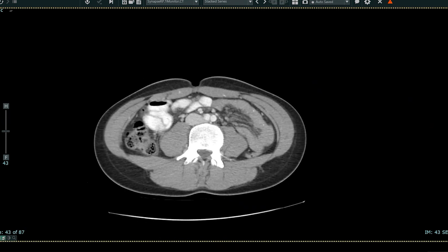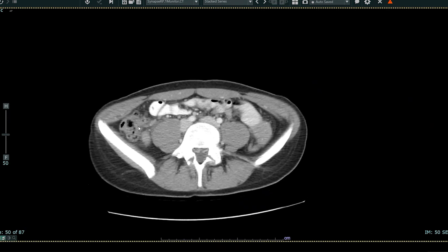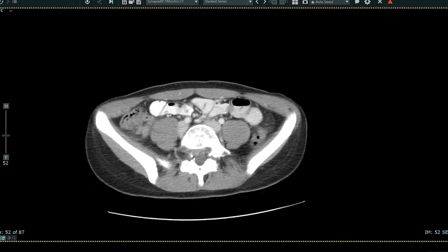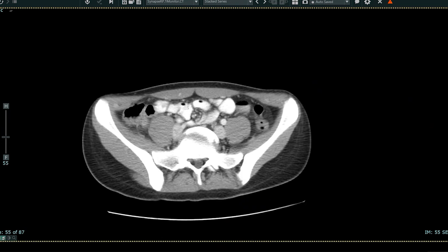And then as we get further down in the abdomen, we start to see bowel loops. These brighter loops here are loops of small bowel — the patient drank contrast and that makes the small bowel loops brighter. And these areas here, which have a mixture of darker and gray color, are large bowel loops.